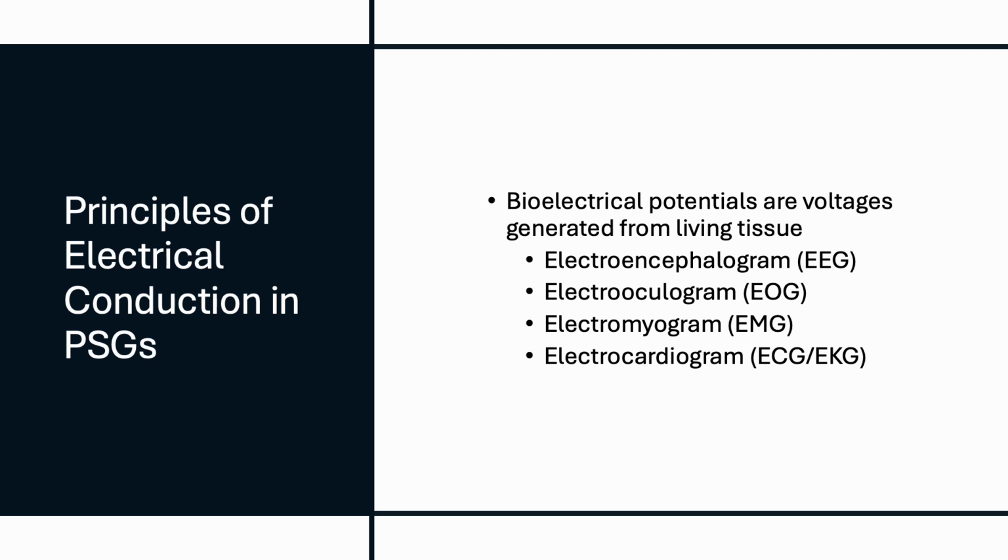The EEG we see are surface cortical brain waves. It doesn't account for deep brain stuff. For that, you've got to go to surgery.